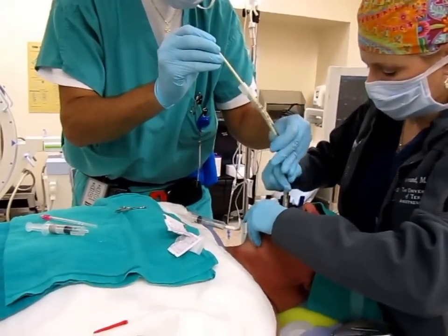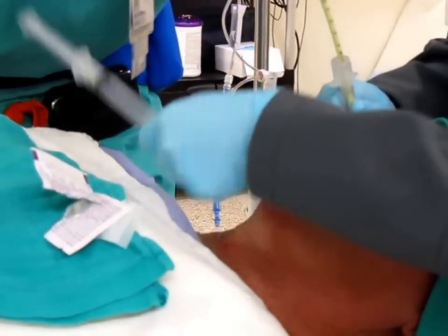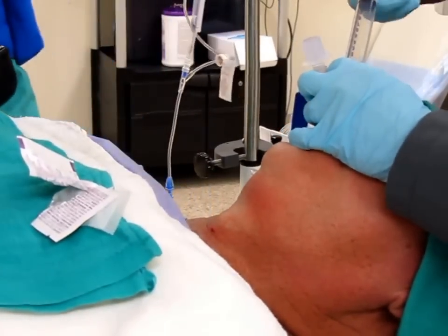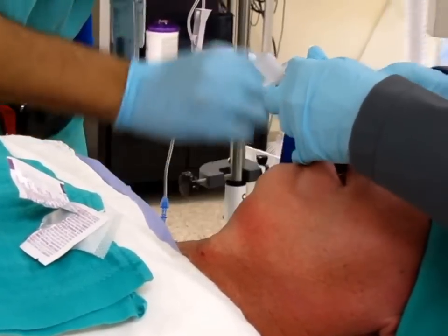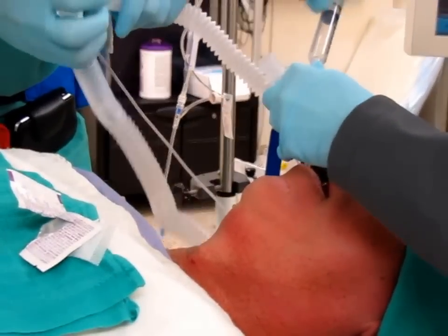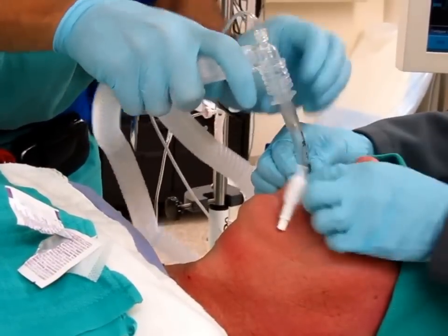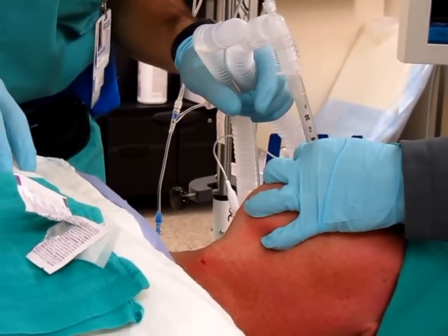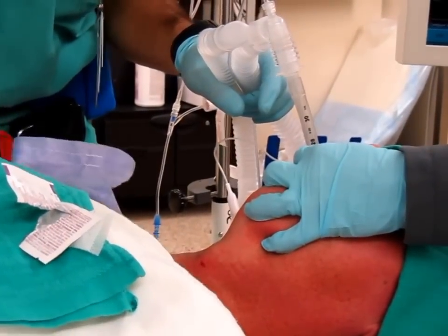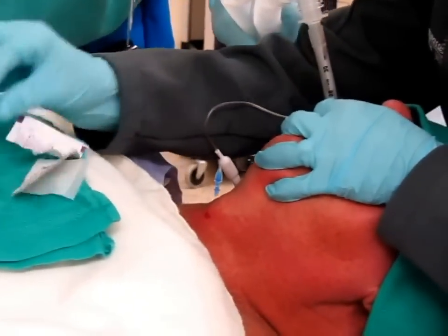You've got the guidewire. You've got your cook catheter. You have fogging inside the ET tube. And now just wipe that off.